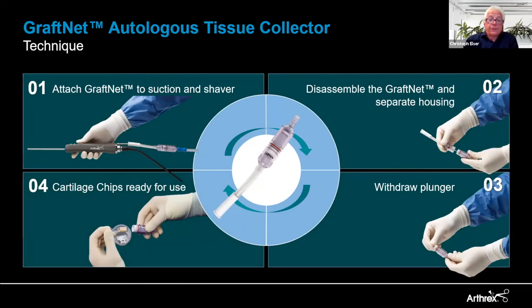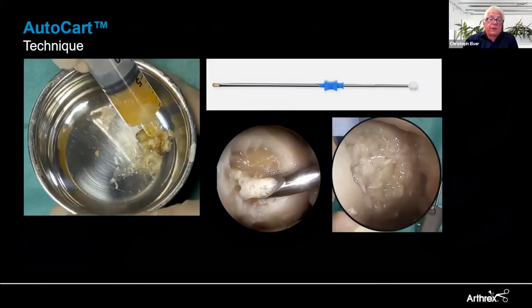These chips are transferred into a small bowl and mixed with a few drops of ACP, which has two effects. First, the cartilage chips become pasty, making them very easy to apply. Second, we start adding fibrinogen contained in the ACP, which is important for fixation. The cartilage paste is then transferred into the application cannula, where the paste can be advanced with a trocar to the tip of the cannula, and then you can apply the cartilage paste into the lesion. You can turn the cannula around and shape the applied paste until satisfied.